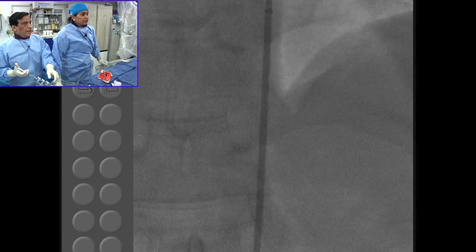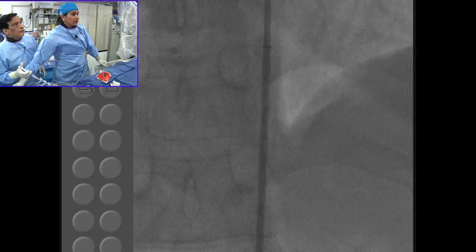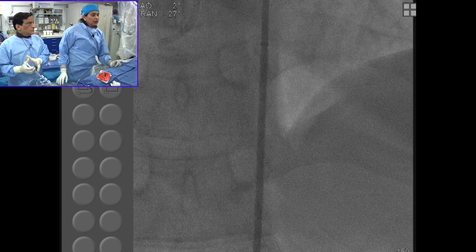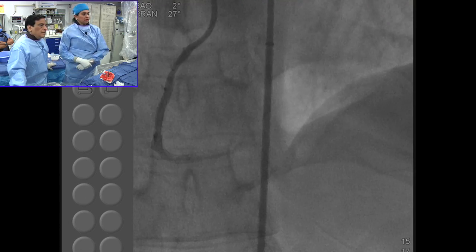I personally do, on the distal, what I call a massage. No, I think the 3.0 stent was too big, because I was not planning to go that distal. I would have put one stent just where the CTO was and come out. No, but remember the distal. Then you evaluate later, and if you needed, you could have gone with a smaller stent.